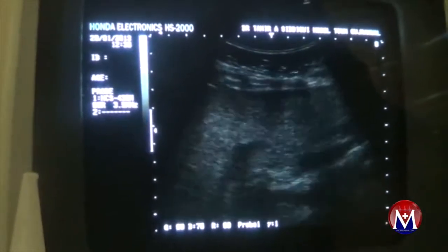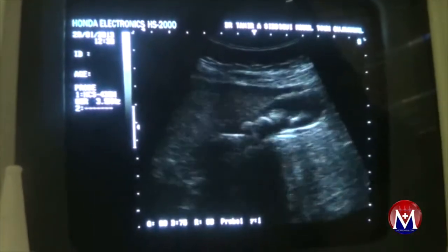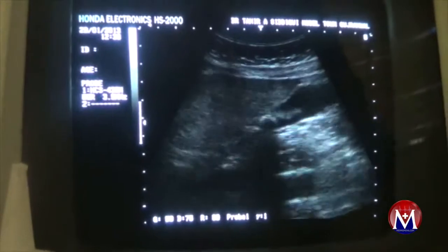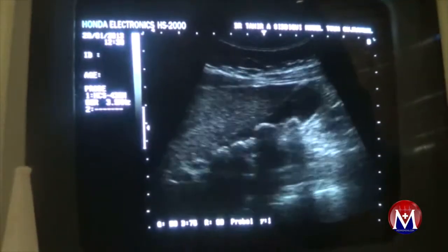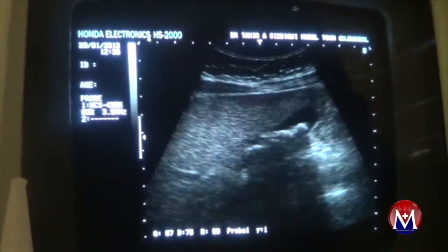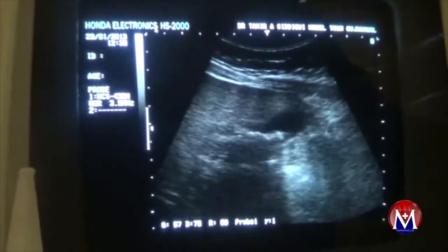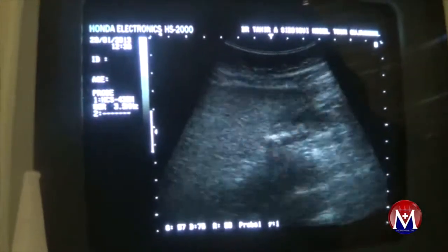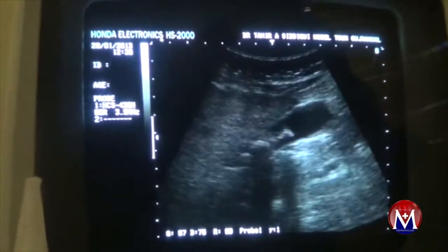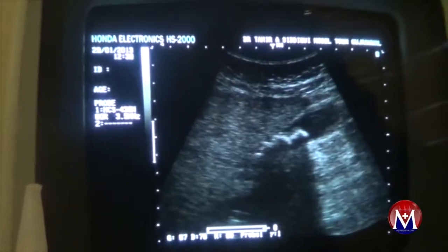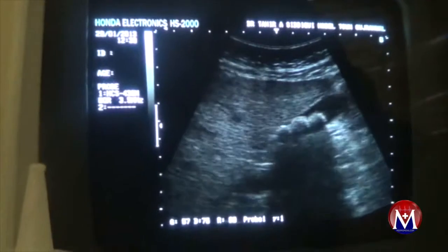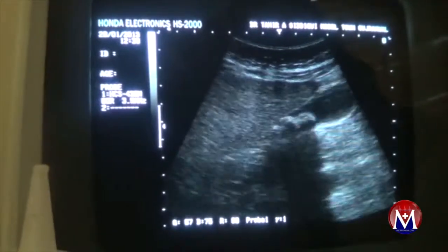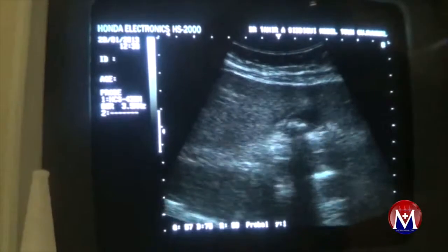This is the view of the same patient in the supine position. We can easily identify the calculi within the lumen of the gallbladder. Note the degree of posterior shadowing — a sharp posterior shadow that we are getting through it.